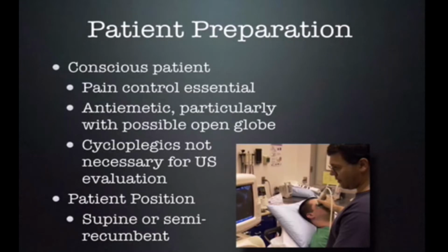And for patient position, I prefer the supine or semi-recumbent position, as the gel stays in the orbital cavity better. You could do this sitting up or any other position, but in a semi-erect or semi-recumbent position, that's the best position for me.